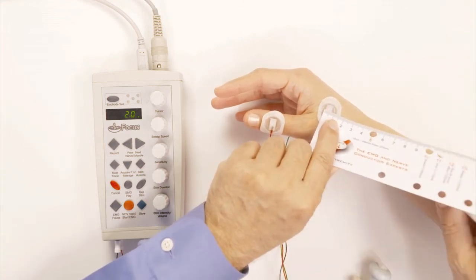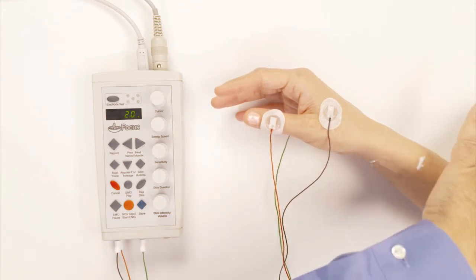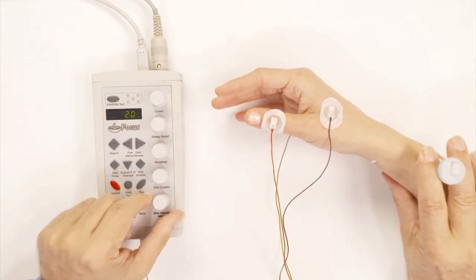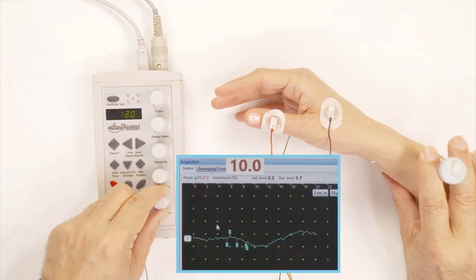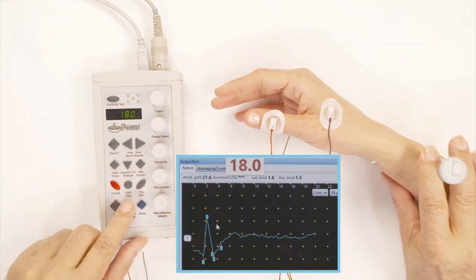I will mark the spot where I'm going to stimulate the radial nerve in the forearm, not at the wrist. Now I use the stimulator, put some cream over it, and I start stimulating the nerve. I'm going to go up in the intensity, and I immediately see that nerve, which is wonderful.